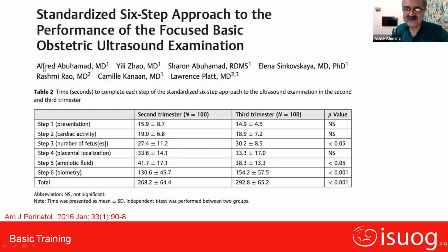So you see, we must understand, of course, that we will in the future make sure that our internet connection is a superior one, so that we can all have the benefit of such an excellent presentation. You saw an extension of the basic ISUOG practice by straightforward everyday images from which you can benefit. The truly important part in today's presentation was the fact that you will cover 50 to 60% of what is required for good perinatal outcomes just by doing a basic scan. The remaining 40% for perinatal outcomes would be covered by doing the anomaly scan. So much can be covered in such a short time that it is absolutely marvelous.